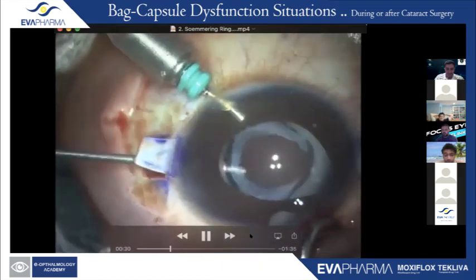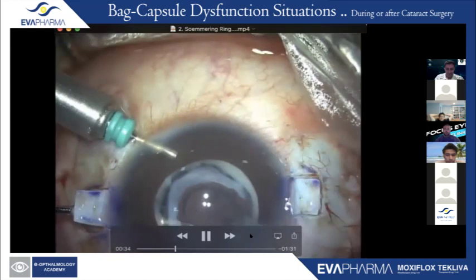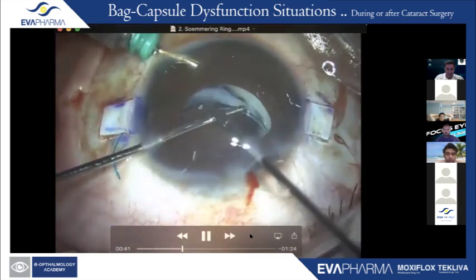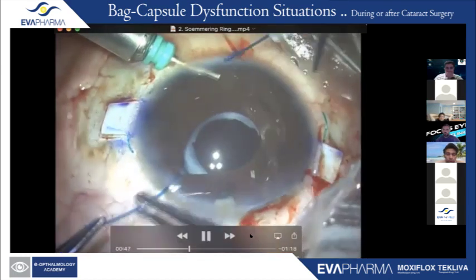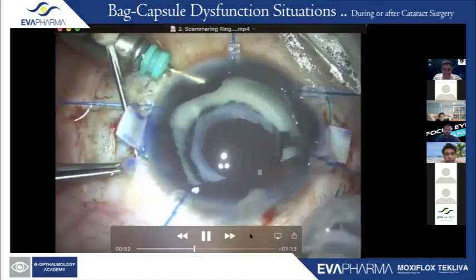So first things first, I do a vitrectomy using both my ports. I am doing my glued intraocular lens first, and I'm not going to show that technique too much, but the most important part over here is to ensure that you get both the haptics out. Now, what happens is usually the pupil shuts down. So you really have to go in and visualize this Soemmering ring.